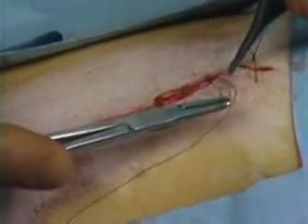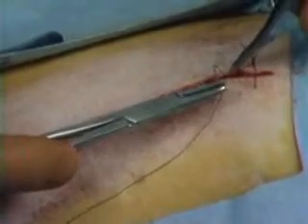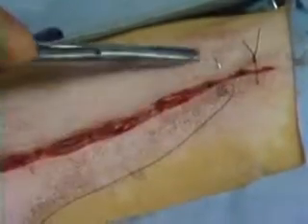This tape will cover techniques only. The student is encouraged to review in current surgery textbooks the specific suture patterns and their indications. After viewing this tape, you will be able to describe 9 listed suture patterns and classify them as to whether they are simple, interrupted, or continuous, and each suture pattern's tendency to oppose, evert, invert, or tension relieve.